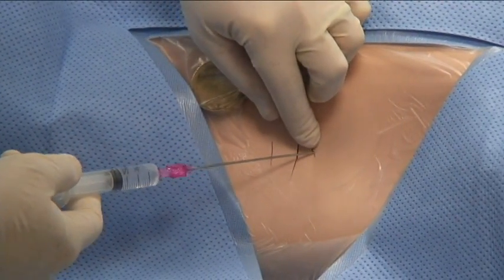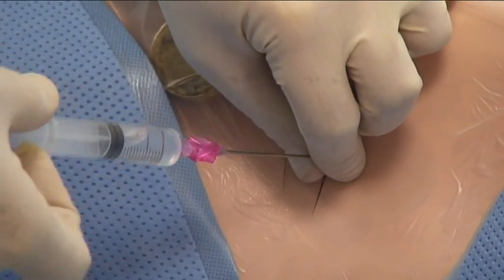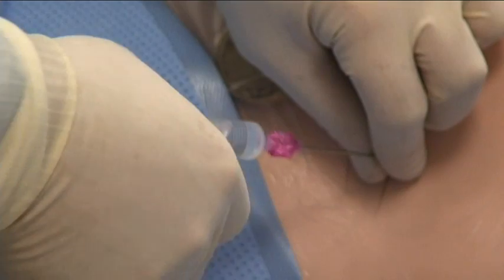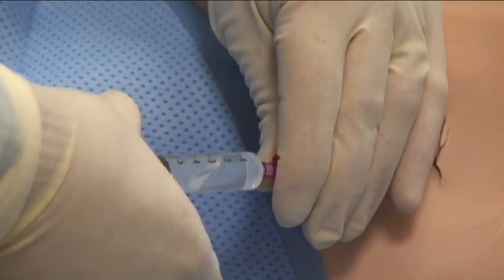the space here. As the needle's going in, I'm pulling back on the plunger, and once I'm in the space, if it's a pneumothorax, I should see bubbles as I'm seeing here in my syringe. So now, at this point, I'm going to hold this needle very steady, and I'm going to take off the syringe.